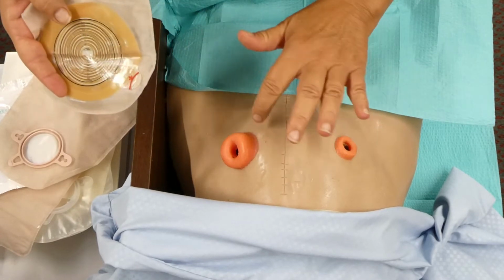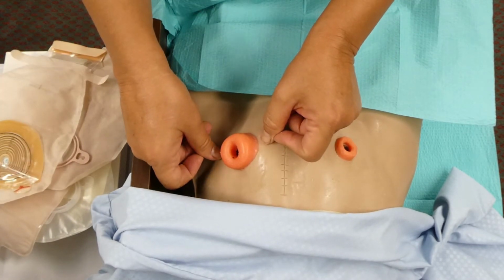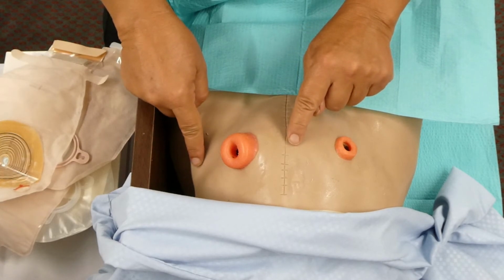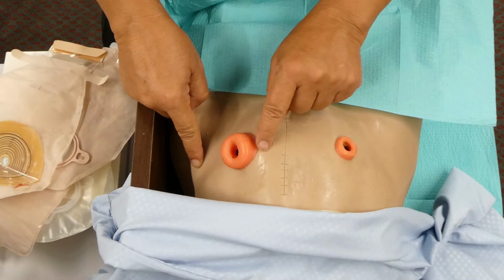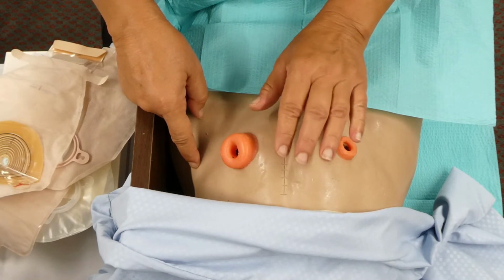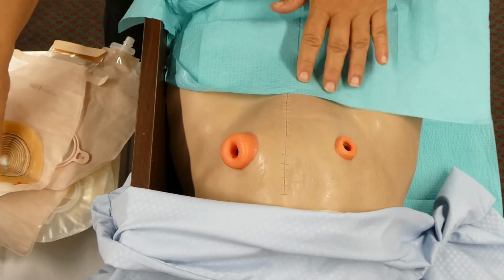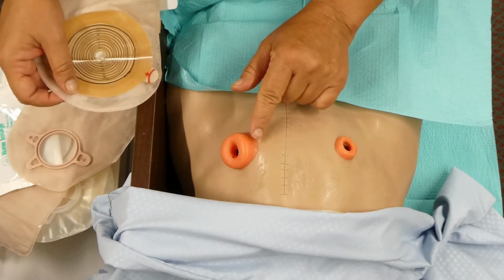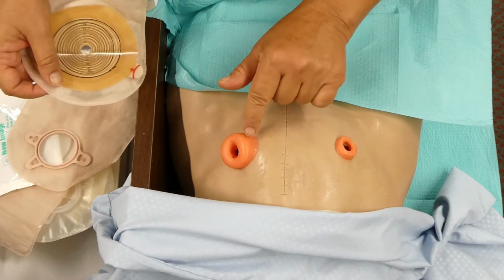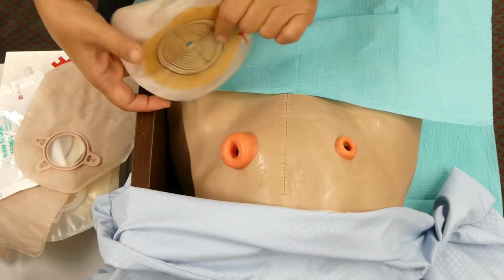The key is you only want to cut it to where it's just covering this. You do not want it way out here where a lot of the skin is open to the fecal matter. This will cause the skin to break down. You don't want it too small where it's not going to fit over the ostomy. It needs to just fit around it nicely, and that takes some measuring.